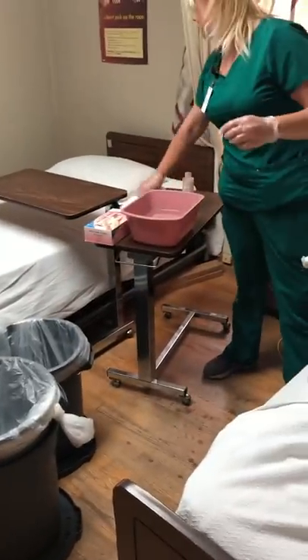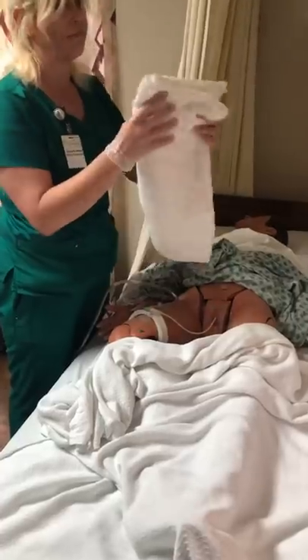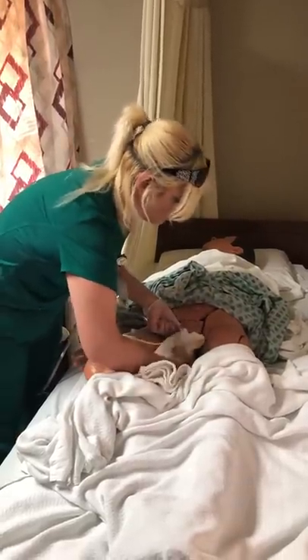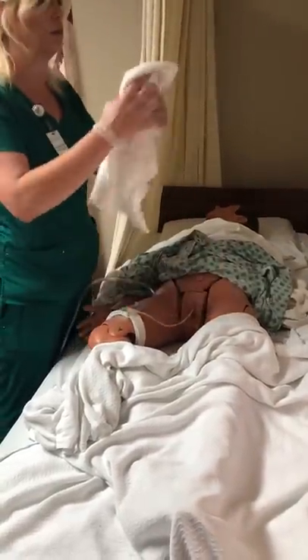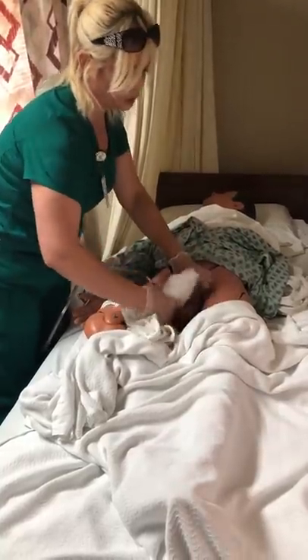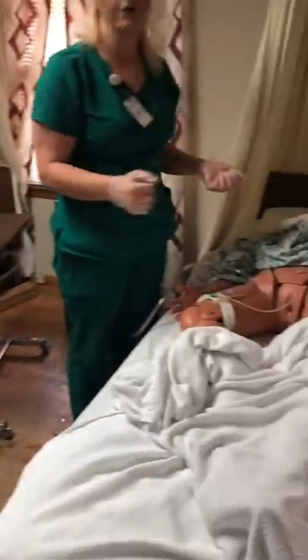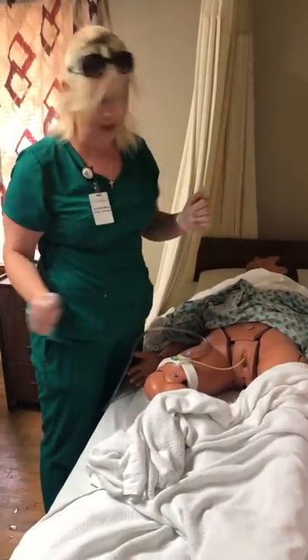Into our dirty linens. Then I'll take my towel and pat dry — 12 to 6, flip, pat dry 12 to 6, inside out, three to four inches down, other side, three to four inches down. You need to make sure that you're never tugging on that catheter tubing, so be careful of that. Now that it's dried, that goes into my dirty linens.